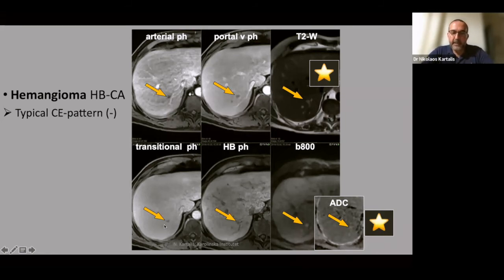Okay, thank you. Continuing, I would like to remind you that if you have a lesion on CT and you want to go forward with characterization with MR, if your suspicion is hemangioma, then Primovist is probably not the optimal contrast agent to start with. But if you have already performed your Primovist exam for a patient with colorectal cancer, and you want to see if these are metastases or hemangiomas, you don't necessarily need to go for a next MRI with extracellular agent.